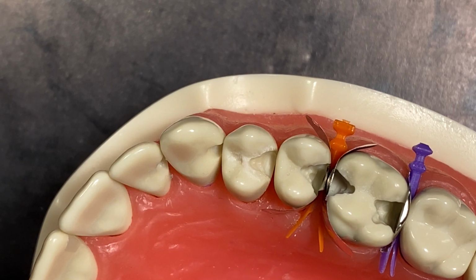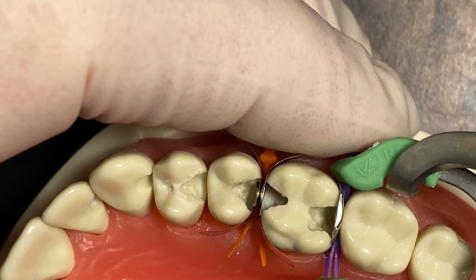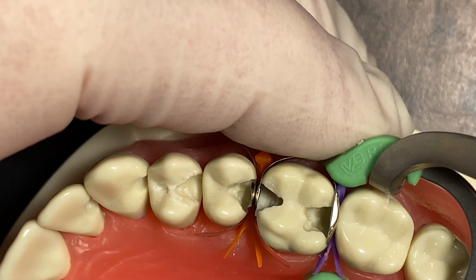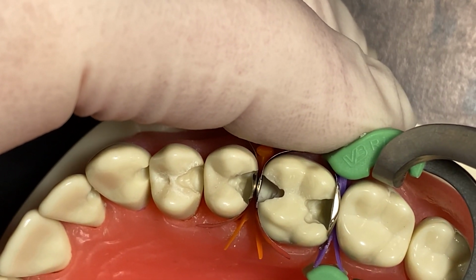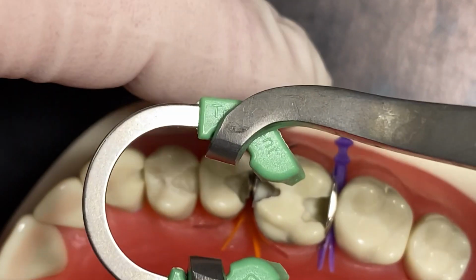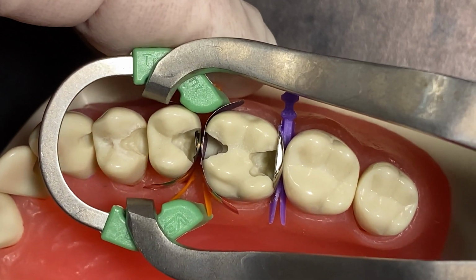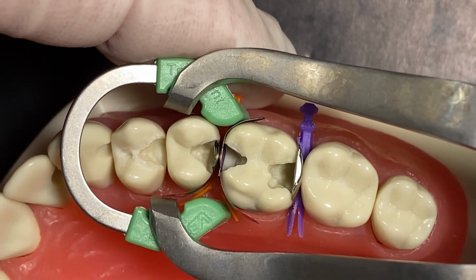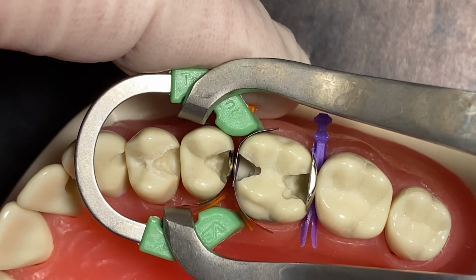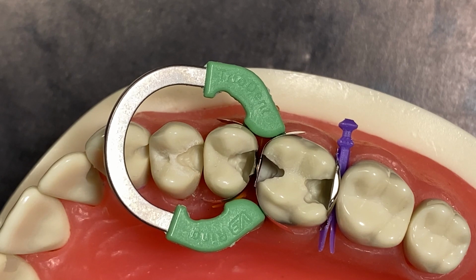Ring hop just means that you put one ring on one area, restore that, put the ring on the next area and restore that. But if you were going to stack, then you would place your ring on your Versa Wedge quadrant first here. And again, you just engage the split wings of that Versa Wedge like so.